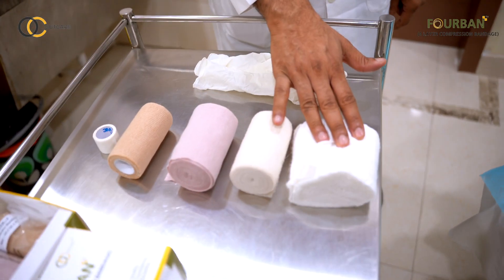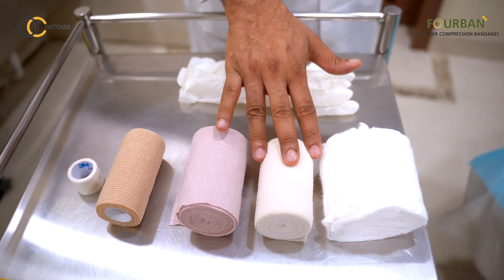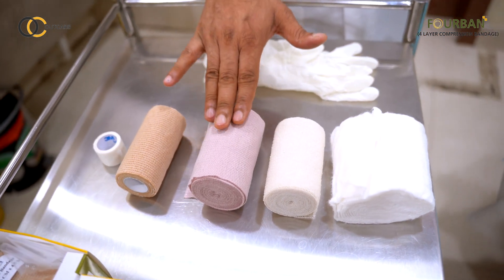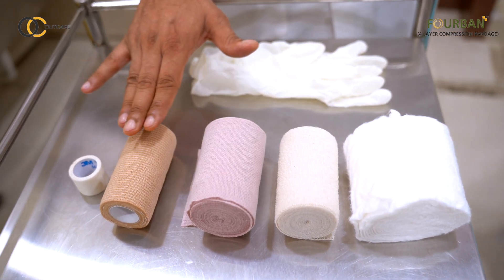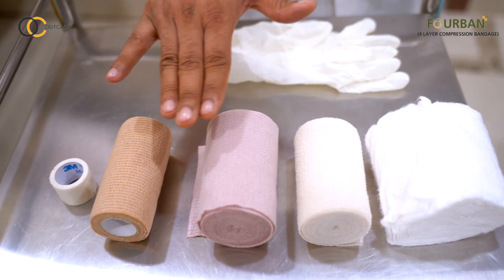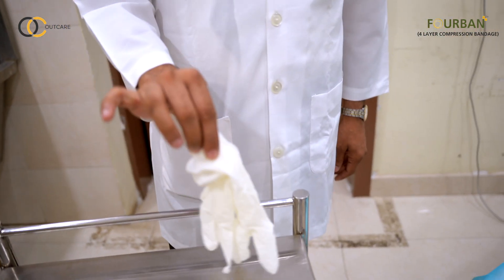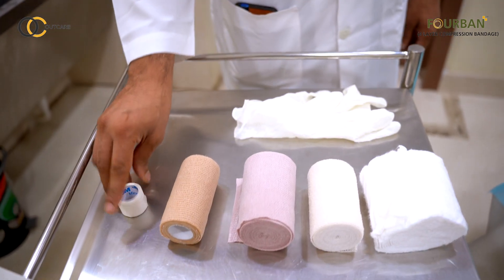This is the first layer, which is an orthopedic bandage or a soft roll. This is the second layer, which is a light compression bandage, also called a conforming bandage. This is an elastic compression bandage, which will be the main component of the 4-layer bandage. And this is a cohesive bandage to keep all 3 layers in place. You will also need a pair of gloves to do the procedure and a paper plaster to keep the bandages in place.